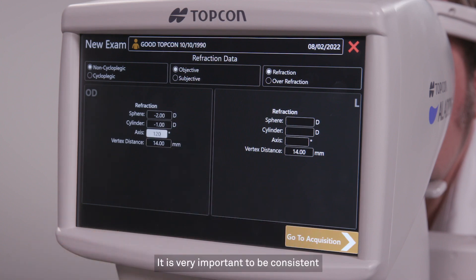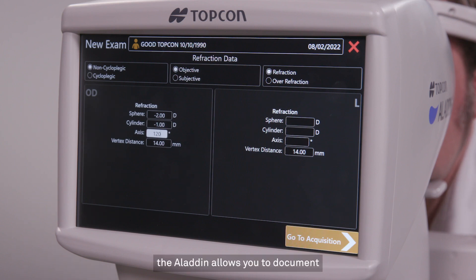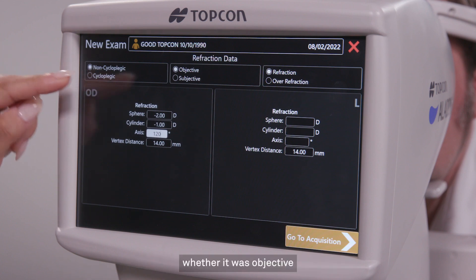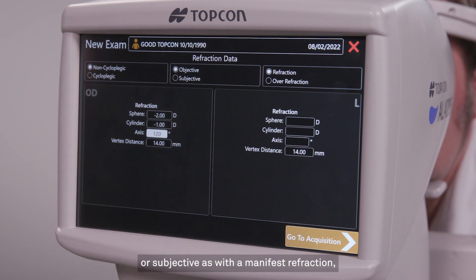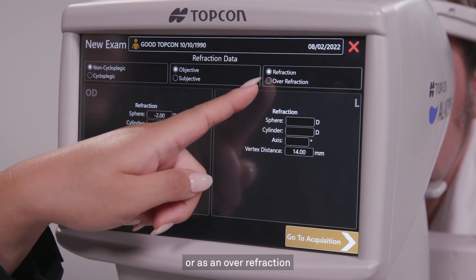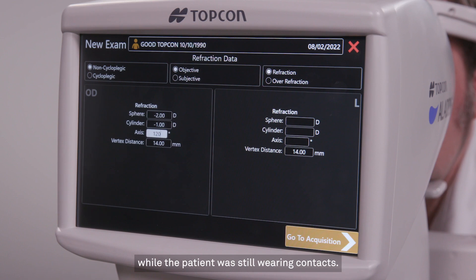It is very important to be consistent when acquiring multiple refractions of a patient over time. For convenience, the Aladdin allows you to document whether or not the refraction was cycloplegic, whether it was objective as with an autorefractor, or subjective as with a manifest refraction, and whether it was performed as a standard refraction or as an over-refraction while the patient was still wearing contacts.